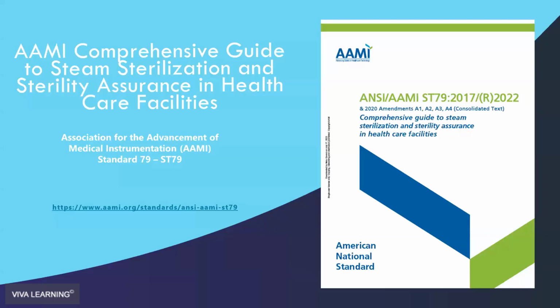And any sterilization pouches used in the US, same thing with indicators, sterilization indicators, must be FDA cleared, and they may not be. So you need to rely on manufacturers that you know and trust, and distributors that you know and trust for purchasing those supplies.